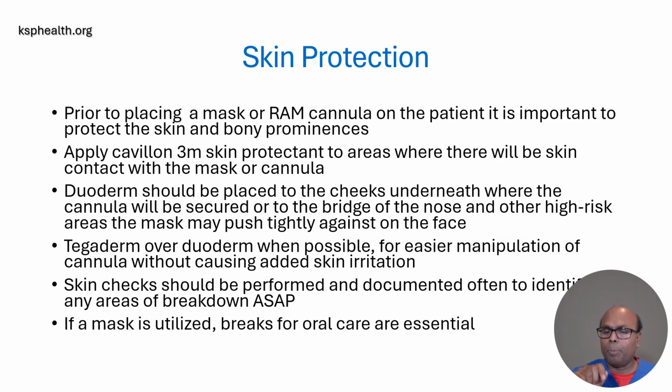Skin checks should be performed and documented often to identify any areas of breakdown as soon as possible. If a mask is utilized, breaks for oral care are essential. So you cannot avoid oral care, and make sure that the skin is protected even before you are placing the nasal cannula or the mask.